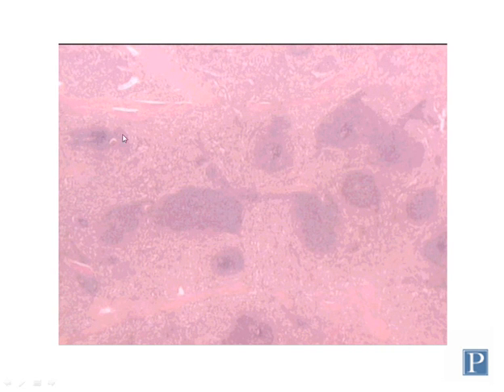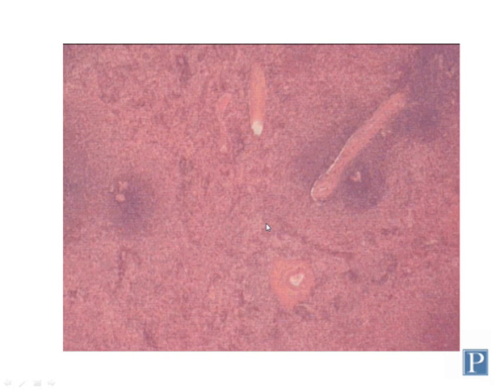The red pulp gets its name because it contains mostly blood found in the sinusoidal capillaries in this region. And so it has a reddish appearance in a fresh specimen. With an H&E stained specimen, the red pulp is eosinophilic and the white pulp is basophilic, so it has kind of a deep purplish coloration. So this is all white pulp here and here. All this stuff here that's more eosinophilic is red pulp.